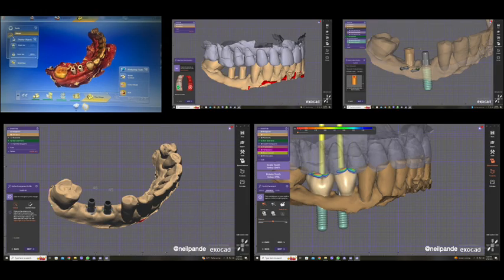Once that is scanned, you can go into any designing software — we're using exocad here — and design it. This design is still under process, and once that design is there, the crown is made.